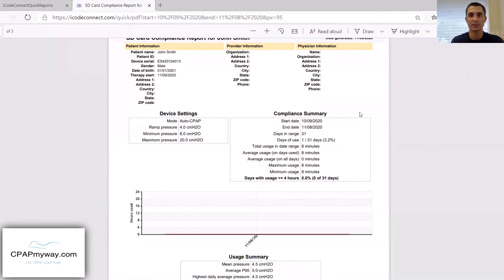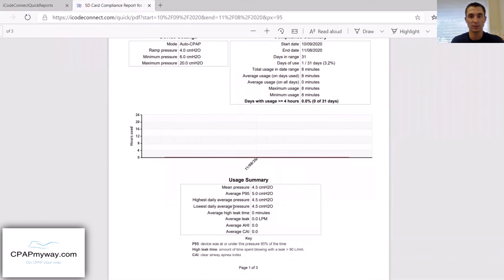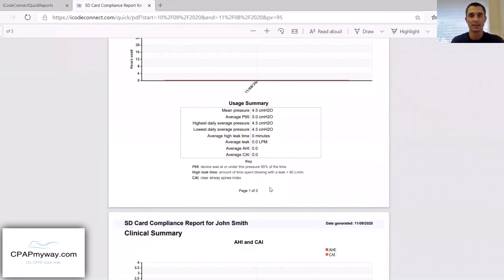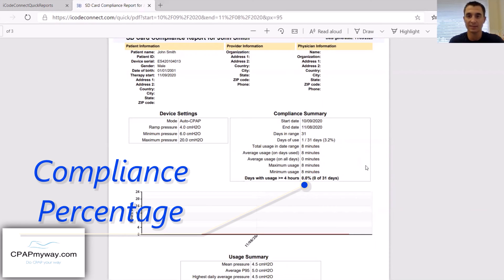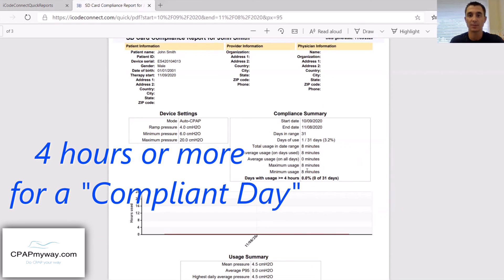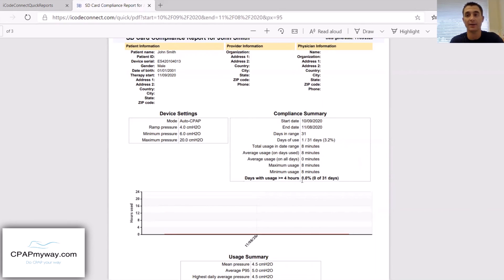On the compliance report, you will see all of your summary, your device settings, everything as far as usage summary, apnea-hypopnea index, your leak, your average pressure. But probably the most important thing to you is your compliance percentage, which is right here. You'll see I am 0% compliant — I've used it one day for eight minutes, which doesn't even count as a compliant day. You have to use it for more than four hours to be considered a compliant day. The industry standard is 70% compliant, so you would need to use it at least 21 out of 30 days to be considered compliant.